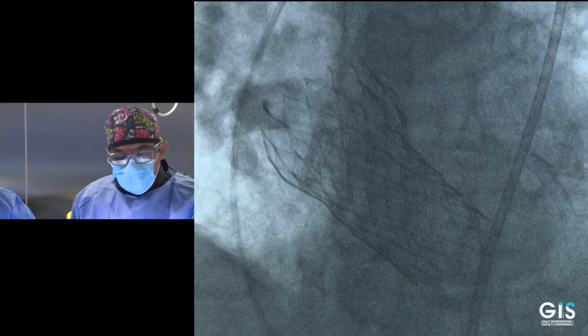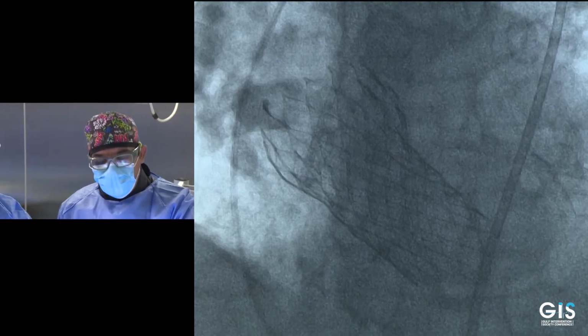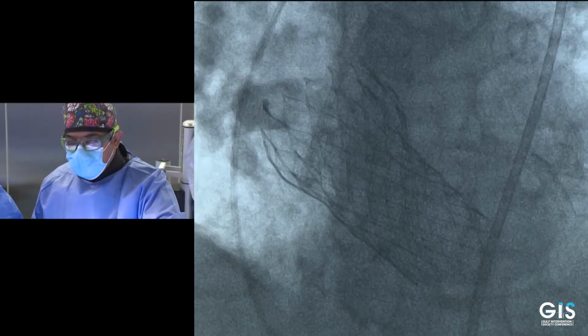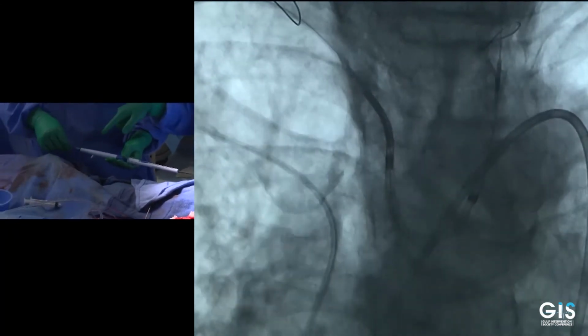And you give protamine after you do that. You need the patient to be anticoagulated during that process. Okay, ready, Dr. Fahad? So under fluoro, okay, show us. Come back, just bring the table toward you down, yes, Salim. Okay, stabilize here. Okay, so you could advance the wire a little bit, then pull number 3.